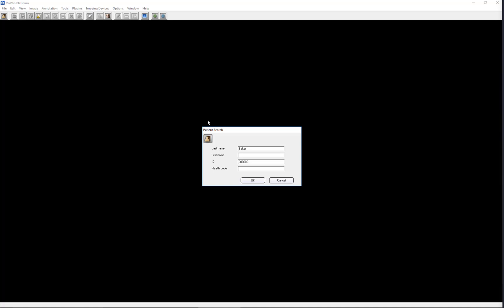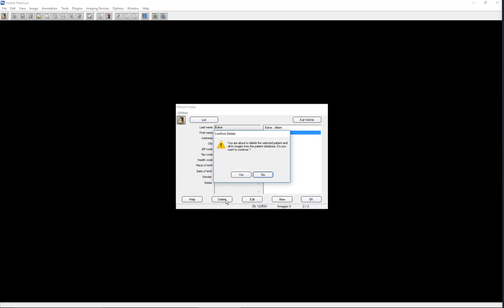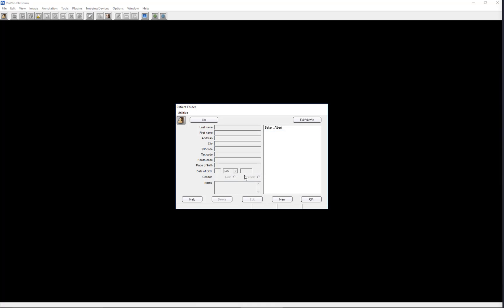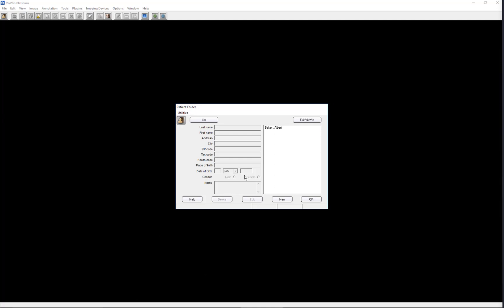A patient may be deleted along with any associated images from the database. First, select the patient name, click Delete, and select Yes to confirm agreement to delete the record. To restore the deleted information, you must restore the database from a backup. The delete function should be used with caution, as a proper backup may not have been made and no restoration of data would be possible.